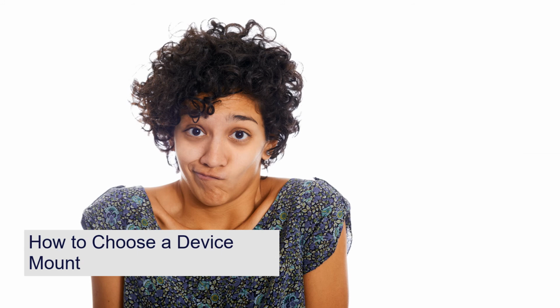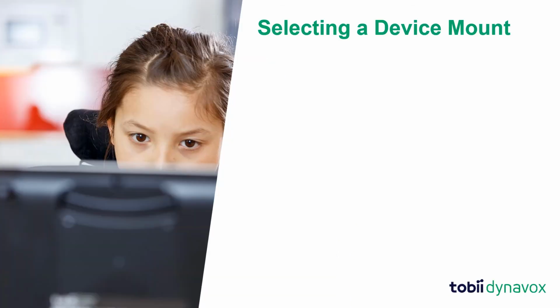Now that we have learned about the types of device mounts and the components of a device mount, how do you choose a device mount? Let's start by asking questions. These are questions that will begin your process in deciding what type of device mount to use. What is the access method of the user?